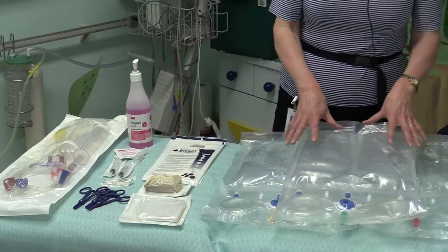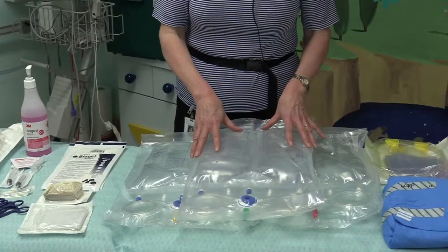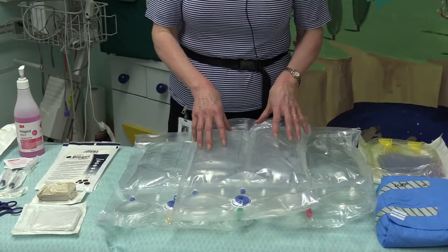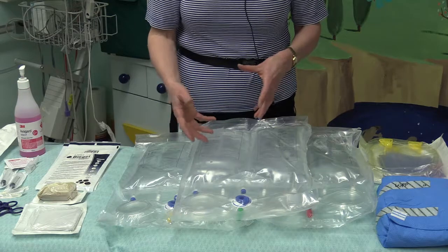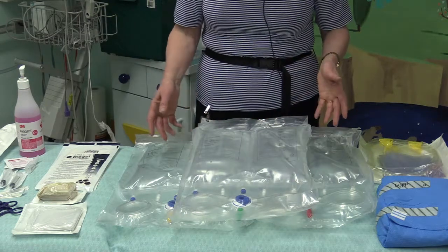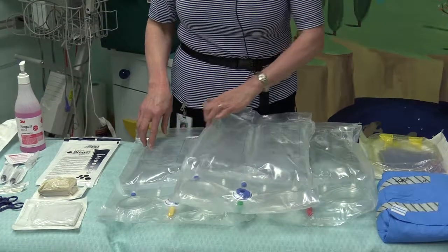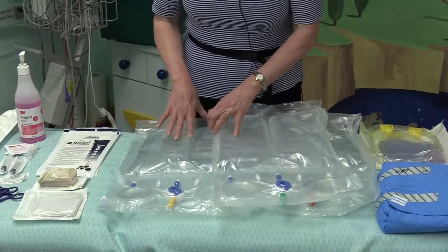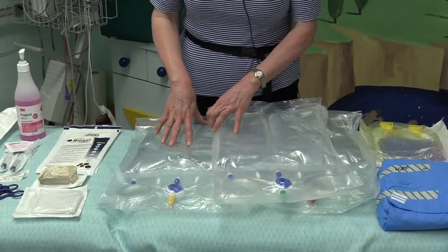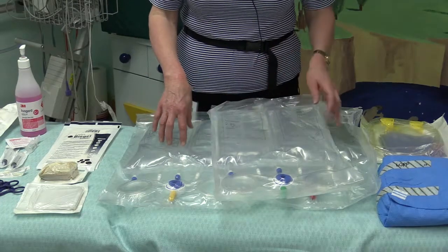Then we have some dialysis solution. There are 3 different strengths of dialysis solution depending on how much fluid the child is going to need to be removed. So the fluid's colour coded and also labelled. We start with 1.5, which is a yellow indicator, and 1.5 is the weaker strength of glucose, so less fluid will be removed when we use the 1.5.